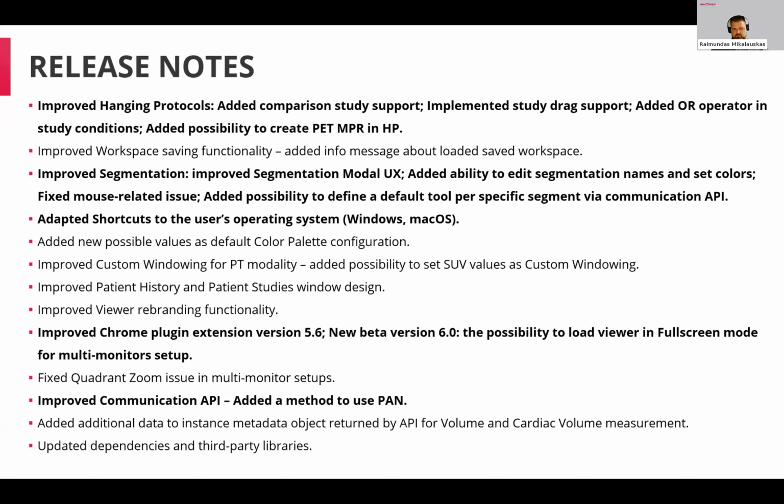Through the communication API, we added extra data for volume and cardiac volume measurements. It's only through the communication API. And of course, updated dependencies and third-party libraries. So that's all from me now. Please, Joshua, now it's your turn to show it in real life.